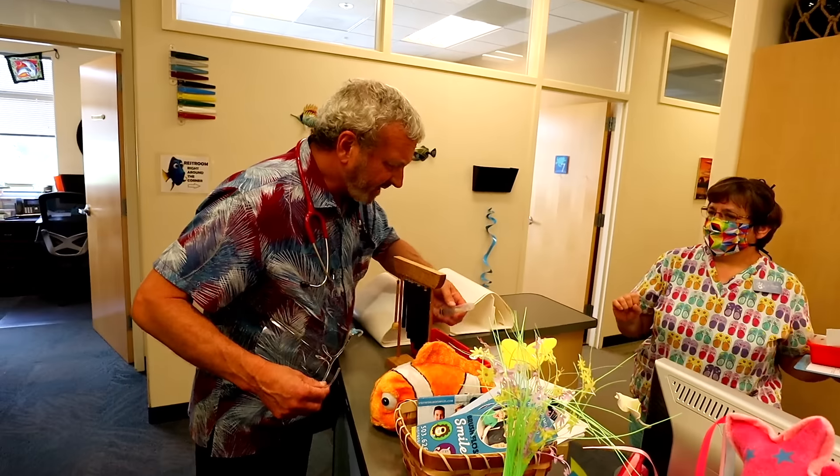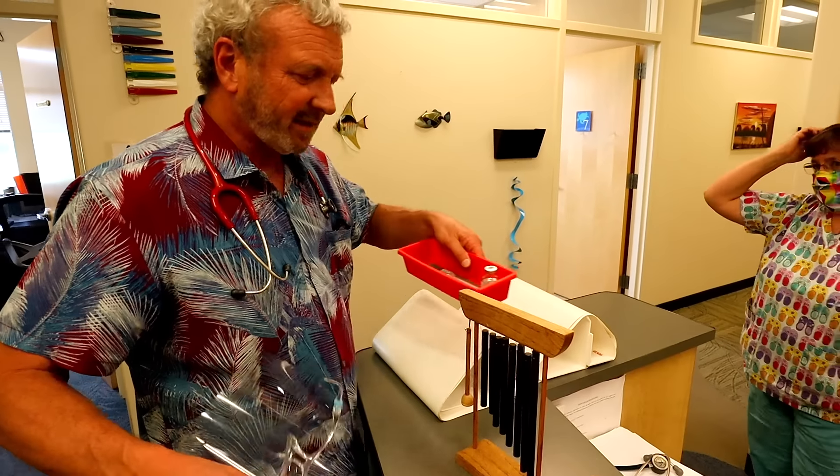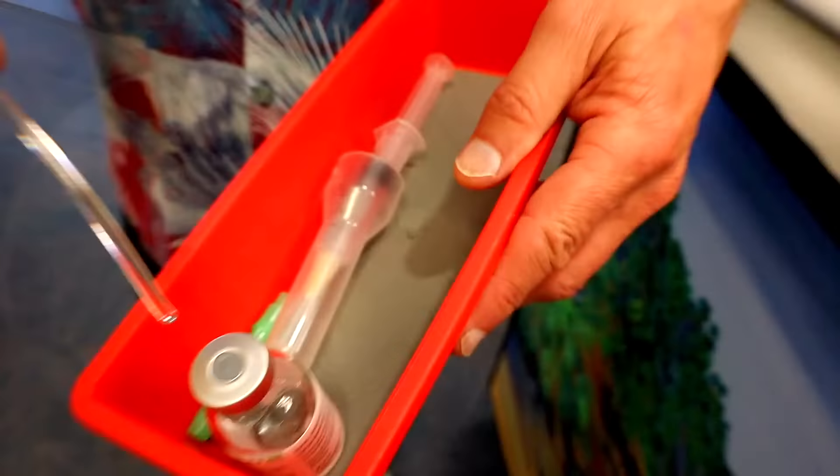Five cc's — it's got a small needle in it already. We have a bigger one if needed. We're rolling! We have a wound on a foot that is four days old, so if it needed sutures we're not going to be able to suture it. This is some lidocaine because if we're going to clean this properly, we're going to numb it up first.